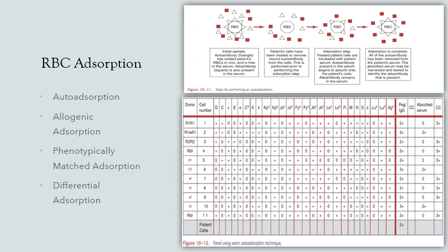Differential adsorption is performed when a patient's phenotype is unknown. So baliktad siya doon sa phenotypically matched adsorption. So again, differential adsorption is performed when the patient's phenotype is unknown, recently transfused, and positive in DAT.